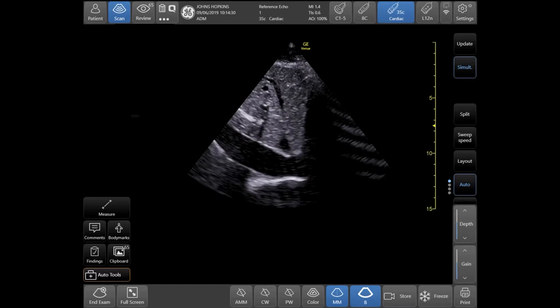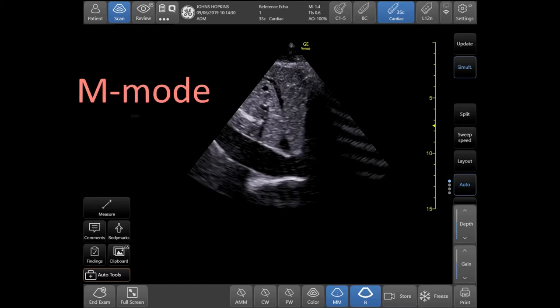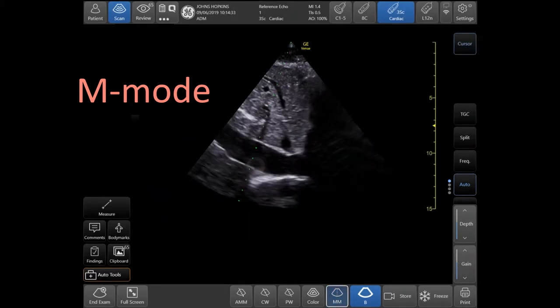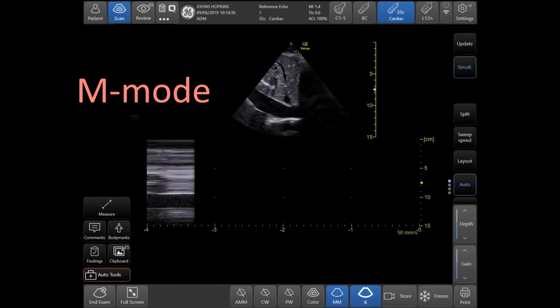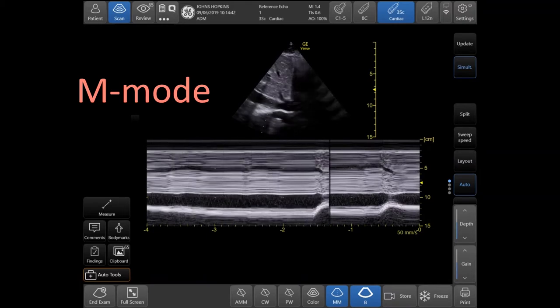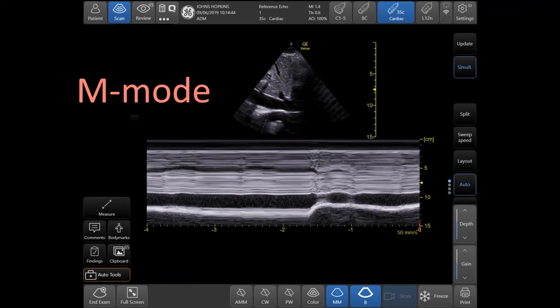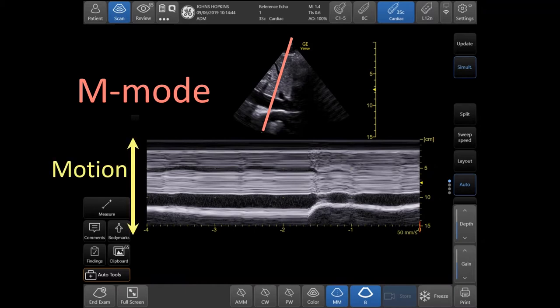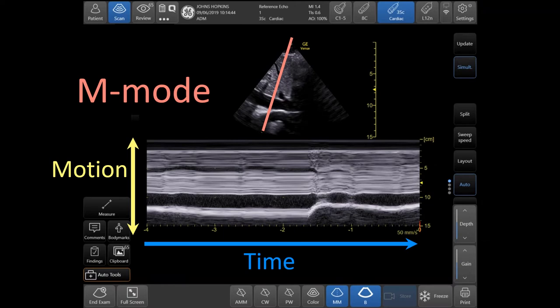M-mode, which stands for motion mode, was one of the first ultrasound modalities developed that allowed ultrasound to be successfully used in medicine. M-mode imaging includes a time scale, whereby reflected echoes displayed along a single line on the vertical axis are placed side by side on the horizontal axis. The vertical axis represents motion of the structures toward and away from the ultrasound probe, and the horizontal axis represents time. M-mode is ideal for the evaluation of motion and timing, especially for subtle or rapid movements.